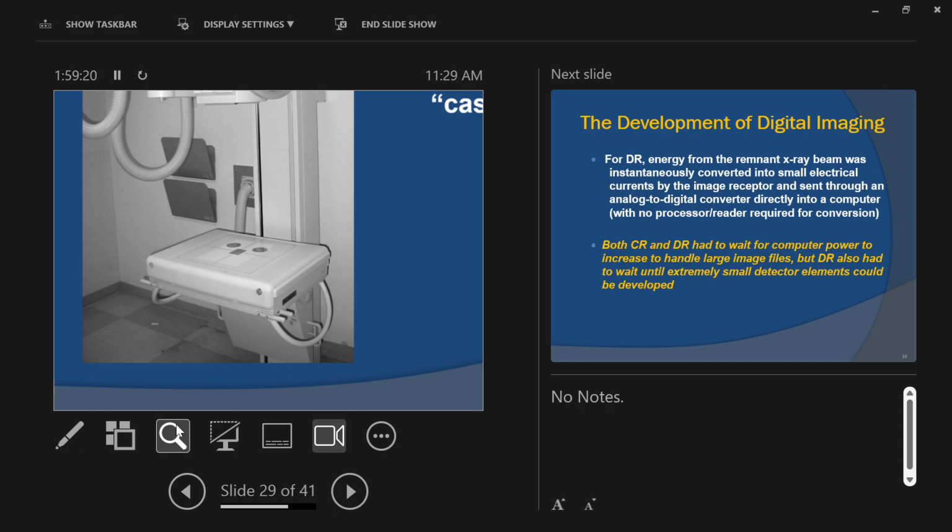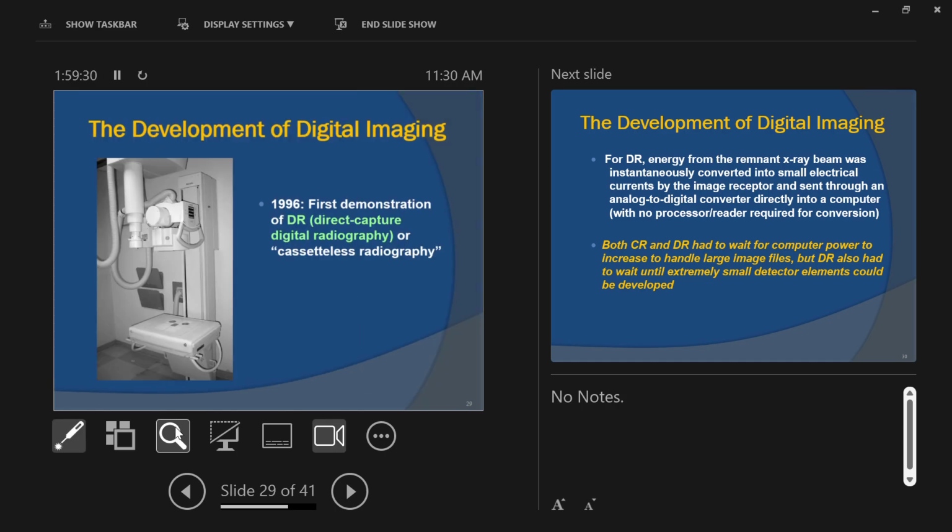They've got their own machine, their own types of equipment, right? So x-rays are just adapted to the type of use that they are needed for. Okay? But yeah, we've got these three basic types. We've got film or film screen, which is a piece of photographic film. We've got CR, computed radiography, that uses a phosphor plate in place of a piece of film and goes to a computer. Okay, you have to take it to the computer.